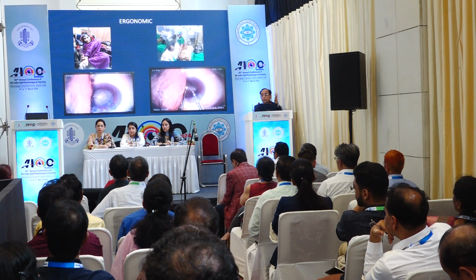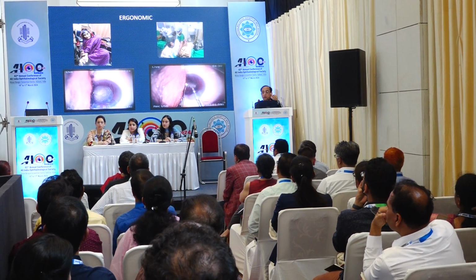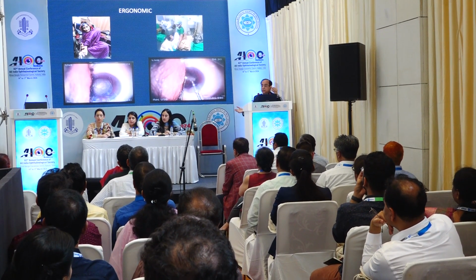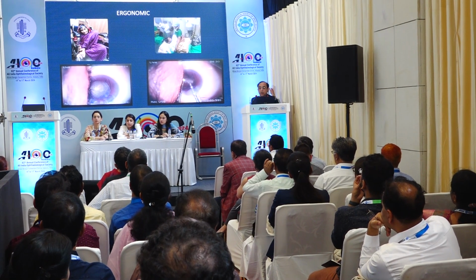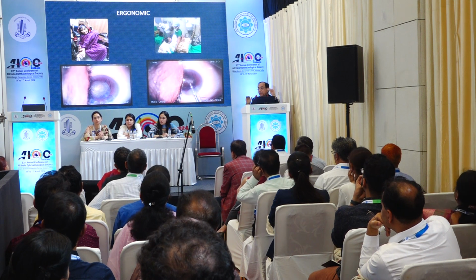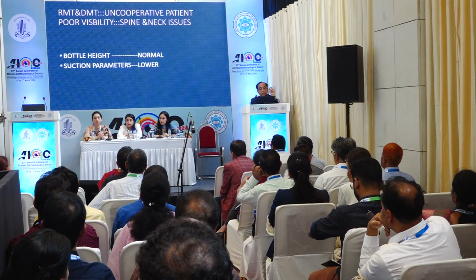Sometimes there may be an ergonomic situation, like this patient, who could not be straightened up. So the incision was lower temporal, the patient had a small pupil, and a Malyugin ring was placed. So the bottle height is normal, but my parameter settings are low. I'm operating standing so that I do not get the surge.